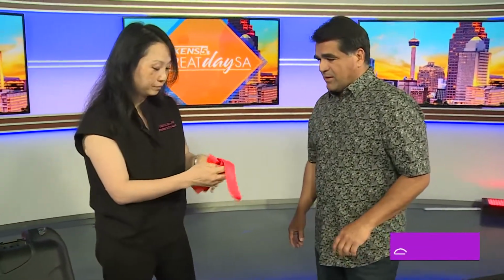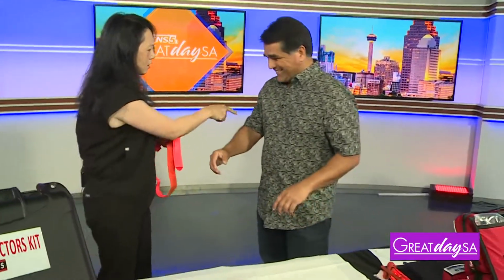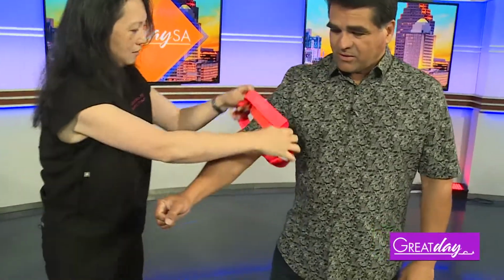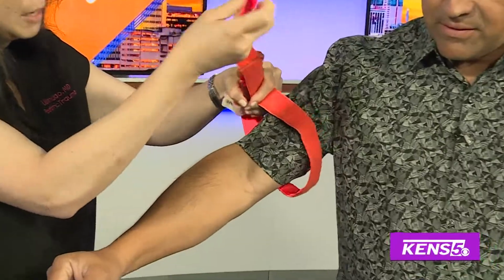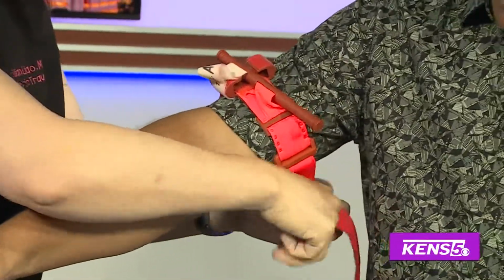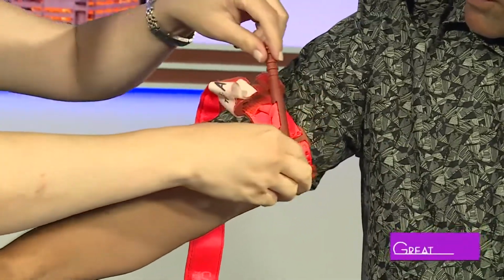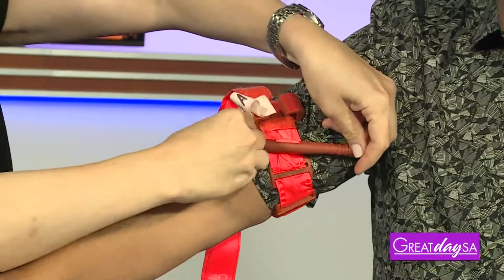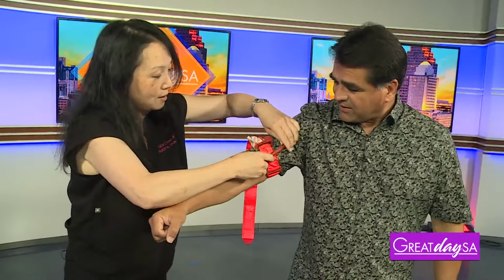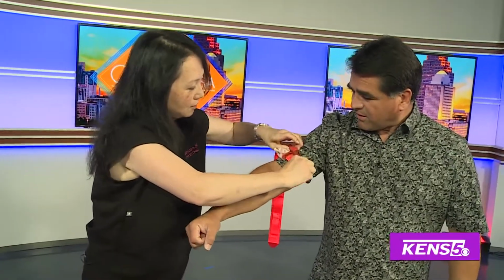Okay. Now, are you going to do this on me? Is that okay? Yeah, that's fine. All right, we're going to do it. Say your arm's bleeding right here. Okay, I got to put the tourniquet on above that. A thin piece of clothing is okay, so the tourniquet will go on snug. You want to hold it and put the Velcro, it's a Velcro system. And I'm going to turn this rod until it won't turn anymore. Like here is pretty much it. And then you lock it.